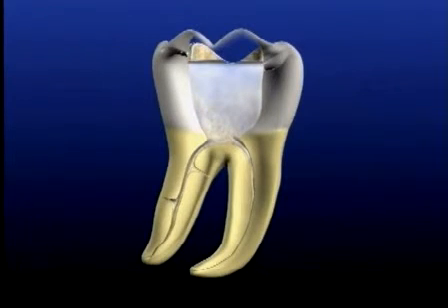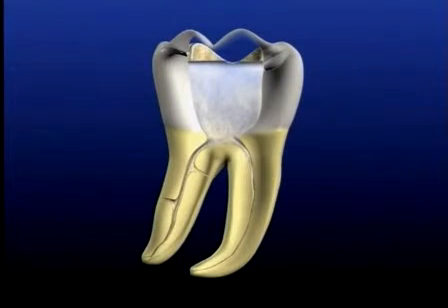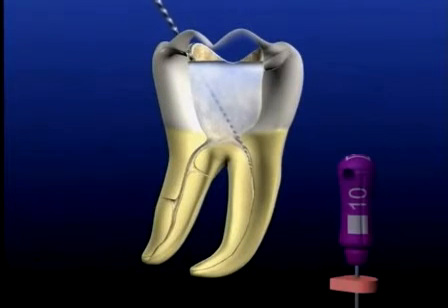Most canals exhibit enough space to accommodate a 10 file. The instrument is fed into the canal and passively pushed apically as its handle is gently rocked back and forth. A 15-degree clockwise rotation is followed by a 15-degree counterclockwise rotation of the file handle. Repeating this motion pulls the file down and into the canal. The handle is rocked back and forth until it's just snug.